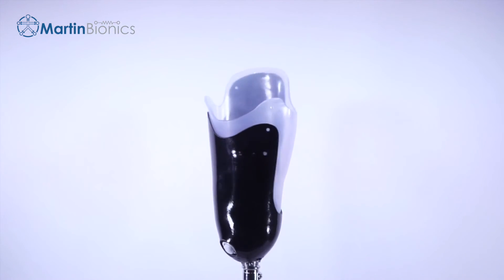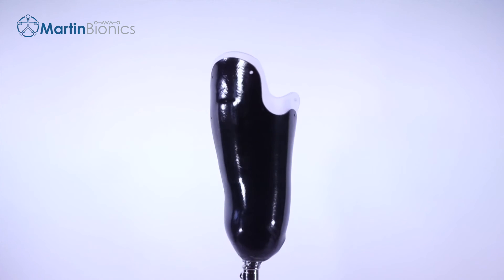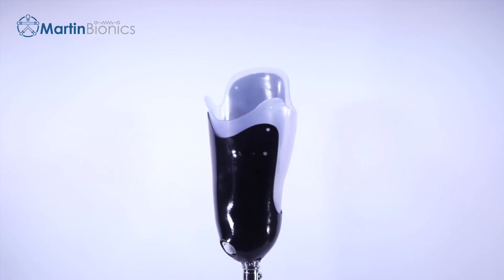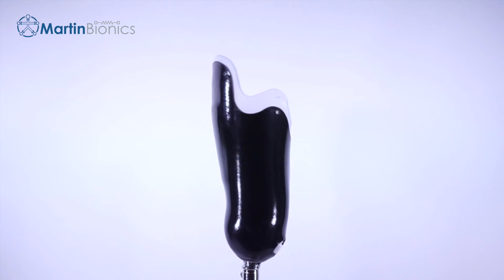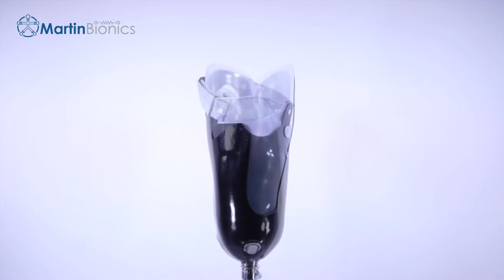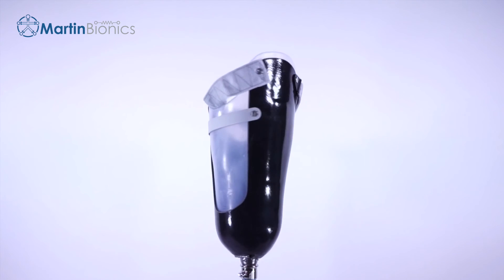Trimming both the flexible inner socket and frame and replacing them altogether with a full swing brim not only eliminates a rigid ischial seat but also eliminates a static brim shape. This is a great solution for users who want to remain in their existing conventional socket but would like a more comfortable brim that fits like sitting into an ultra-comfortable climbing harness or hammock. Begin by adding the Swing Webbing using the same mounting locations.